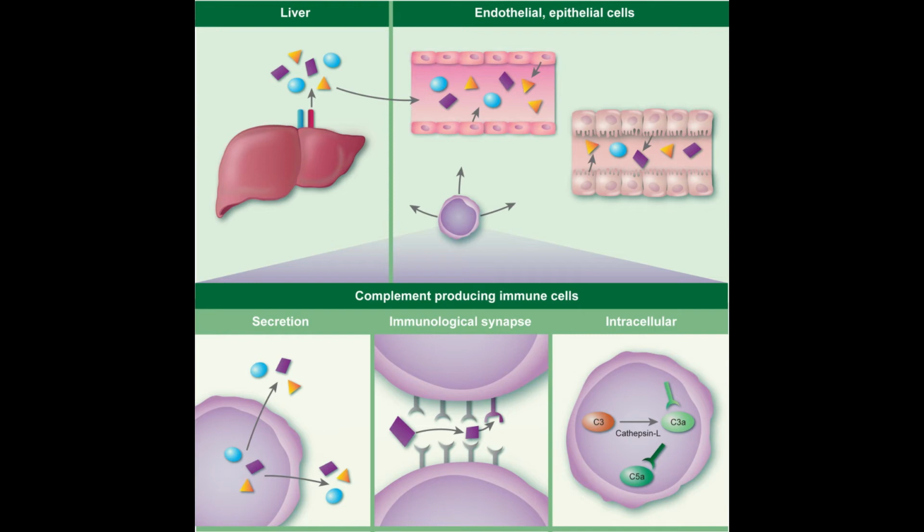Now we're going to talk about complement fixation testing. The complement itself can actually be used as a reagent in this test, known as complement fixation, because complement fixation occurs after the binding of antigen and antibody. Uptake of complement can be used as an indicator of the presence of either specific antigen or antibody. This technique has been used in the detection of viral, fungal, and rickettsial antibodies.